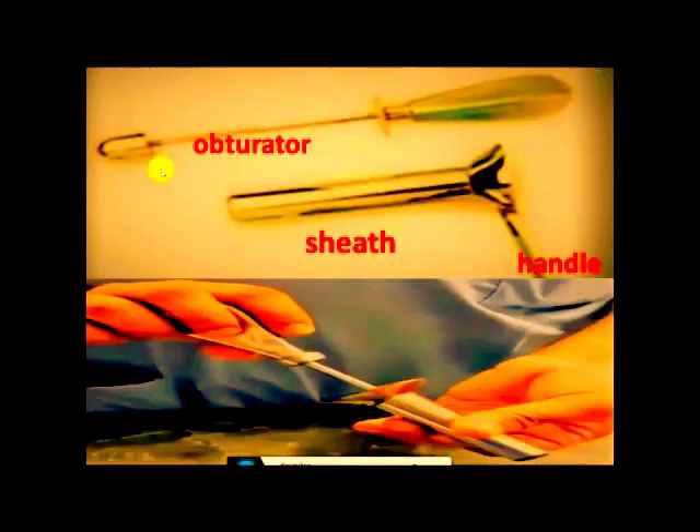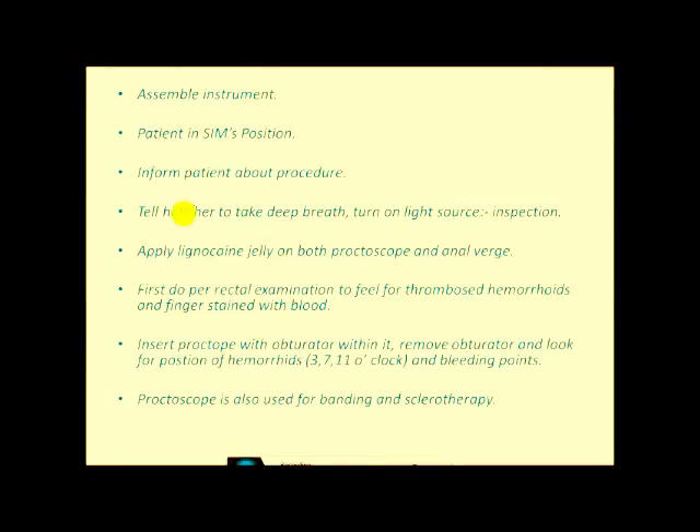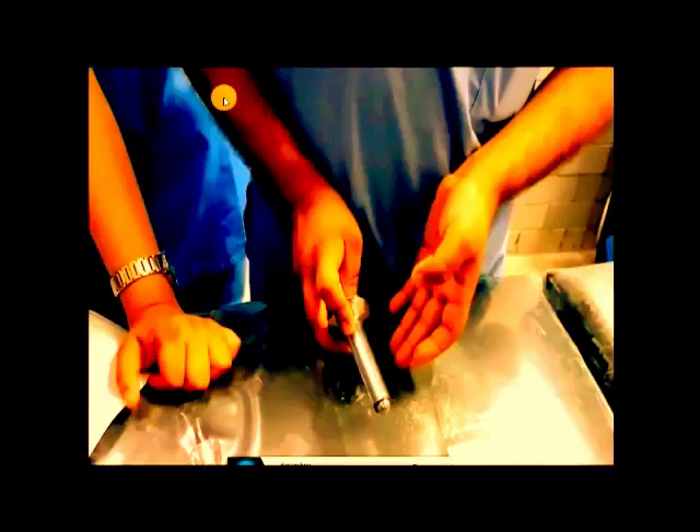These are the parts of the proctoscope: this is the obturator, this is the sheath in which the obturator fits, and this is the handle. This shows the obturator being fitted into the sheath, and this is the final assembled position to make it blunt and non-traumatic. Before doing proctoscopy, you should assemble the proctoscope like this.